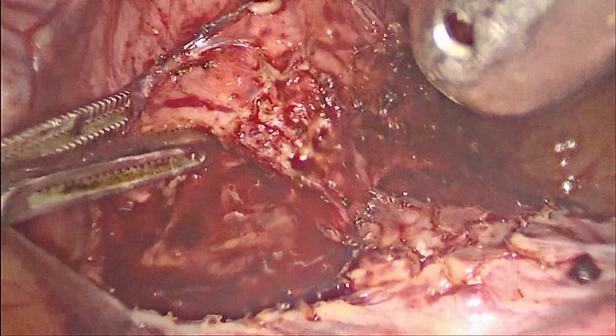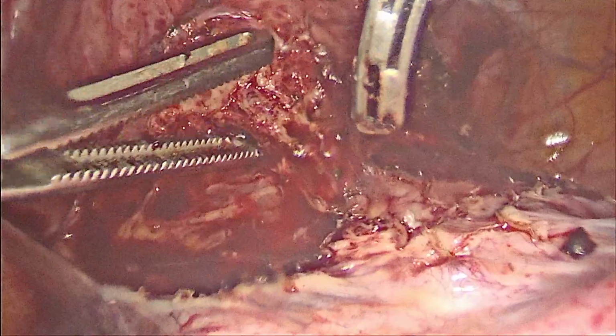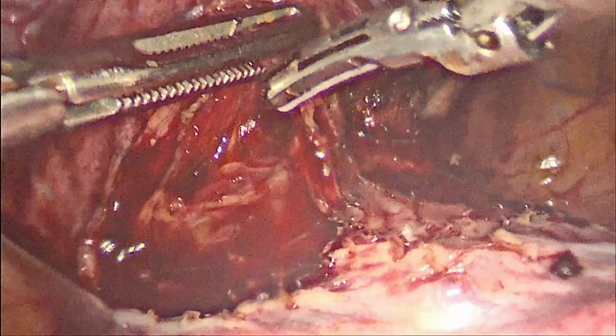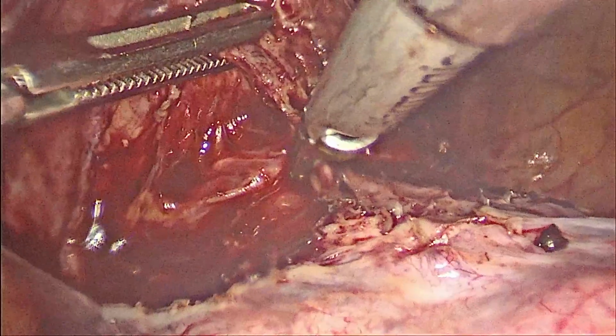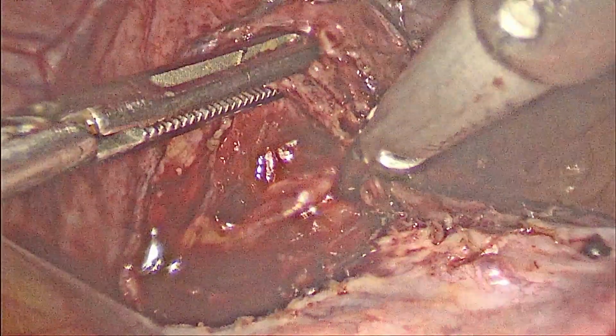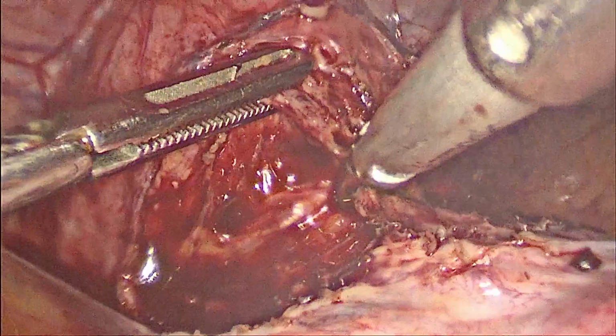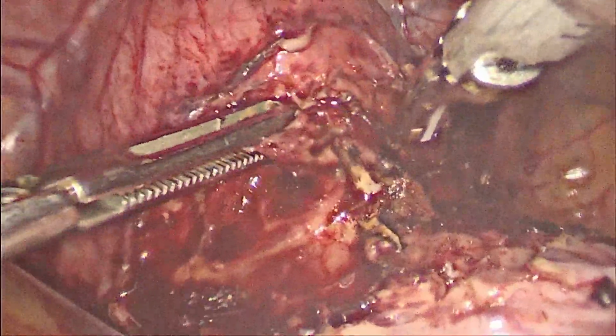Now we can properly identify the fibrous band of tissue and separate the bladder clearly. So now we are taking a good chunk because we are aware of where the bladder is and where the scar tissue is. Till then we were doing dissection fiber by fiber, millimeter by millimeter.